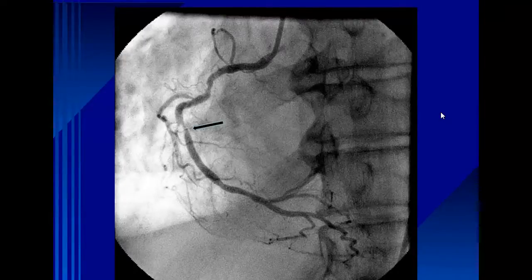This is a typical coronary artery. In many of our patients, I'd say it's unfortunately too typical, and you can see the stenosis in the mid-segment. So the question I go back to is, what are you looking for? Patient comes to the emergency department with chest pain. Are you looking to know, do they have coronary artery disease?